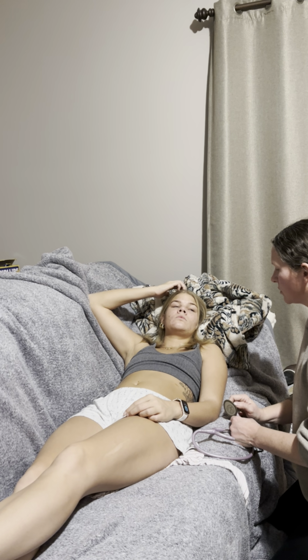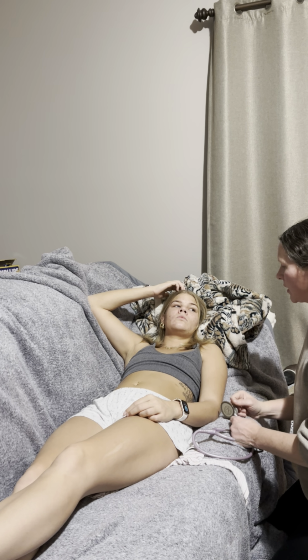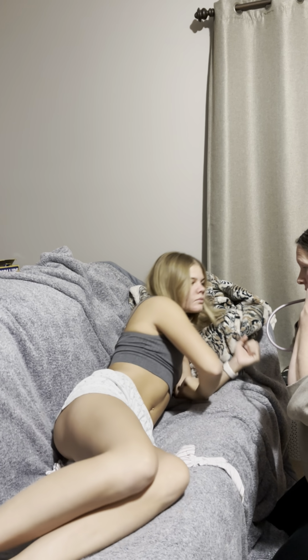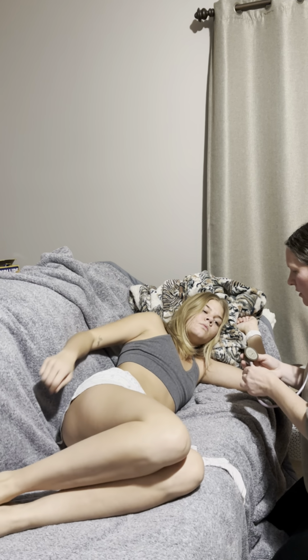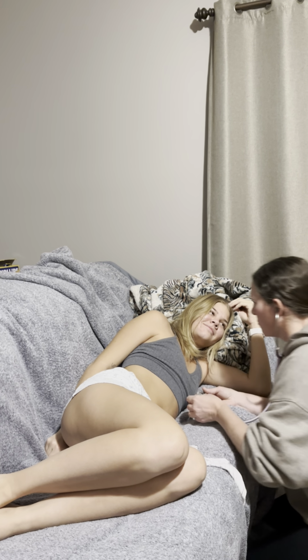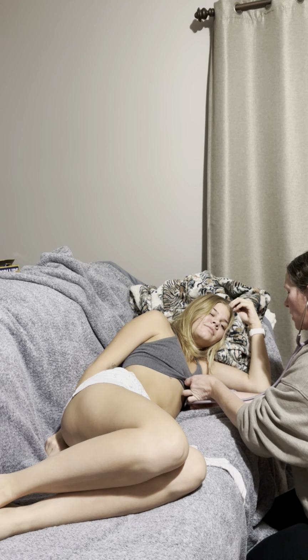So what I am going to do is have you go ahead and turn on your left side, and I'm going to use my bell, and I'm just going to be listening at that point of maximal impulse actually for mitral stenosis, so murmur or S3, S4.